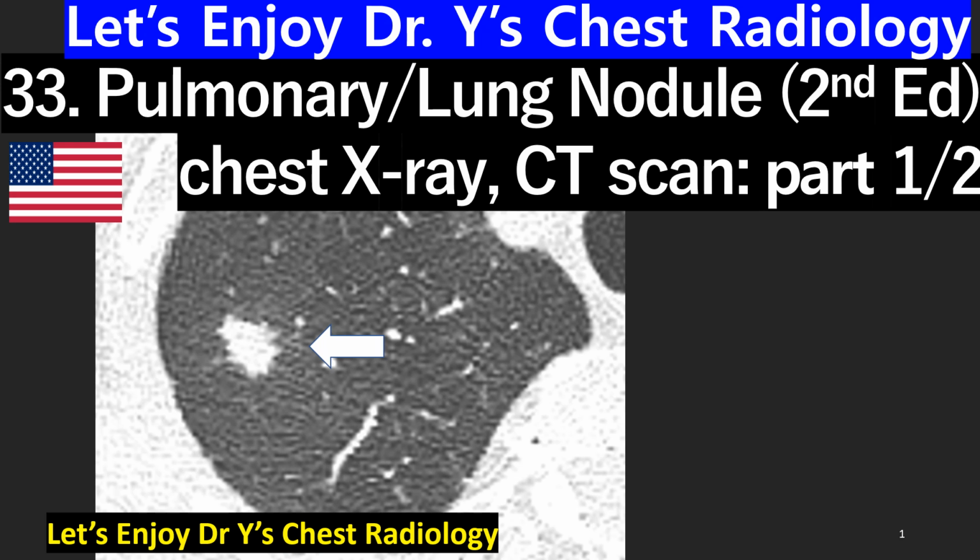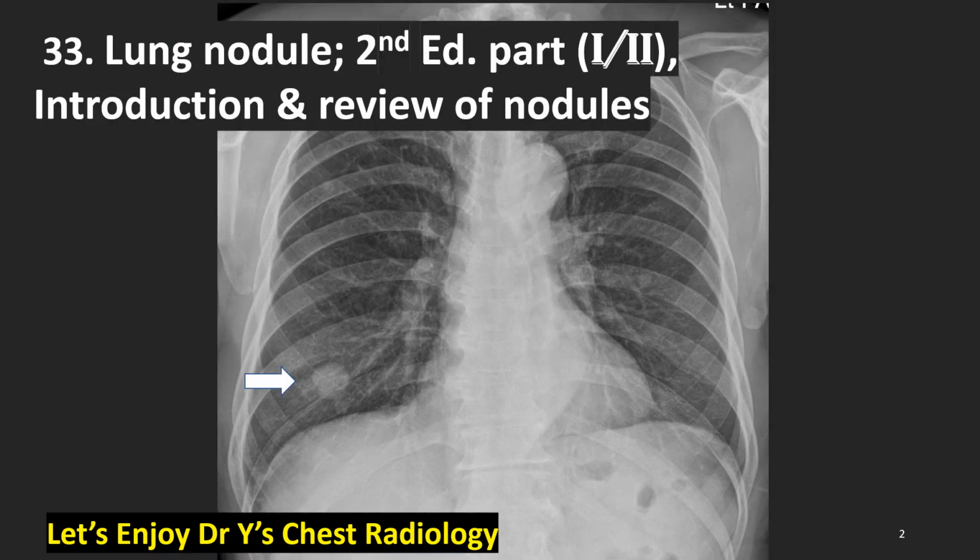Today, chapter 33, pulmonary nodule, lung nodule, second edition, chest x-ray and CAT scan findings, part 1 of 2. Let's go. I made this second edition revision of the lung nodule video since there has been an update of lung nodule definitions by the Fleischner Society in 2024. This chapter is about the introduction and review of the nodules. The images of the nodules will be next time.